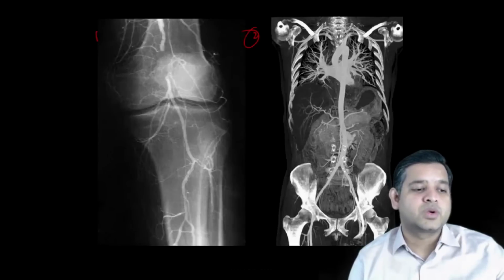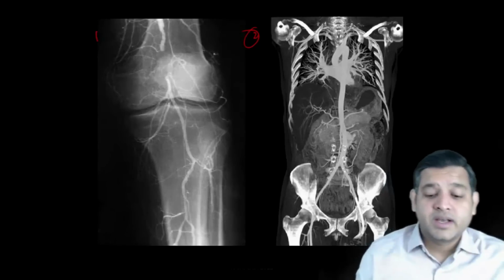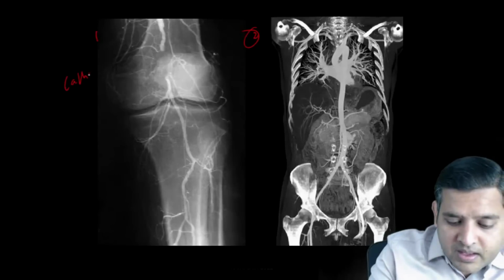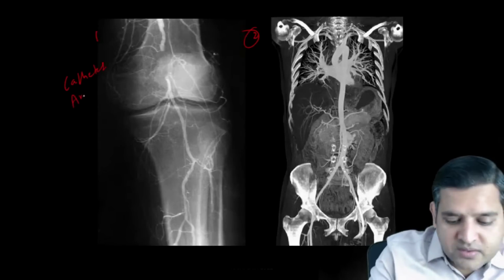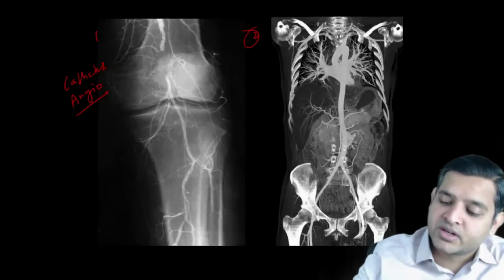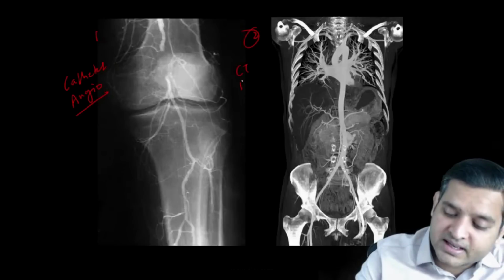Now the point to be noted is, if it's a radiograph, it's a catheter angiography. If it's a CT scan, it's a CT angiography.